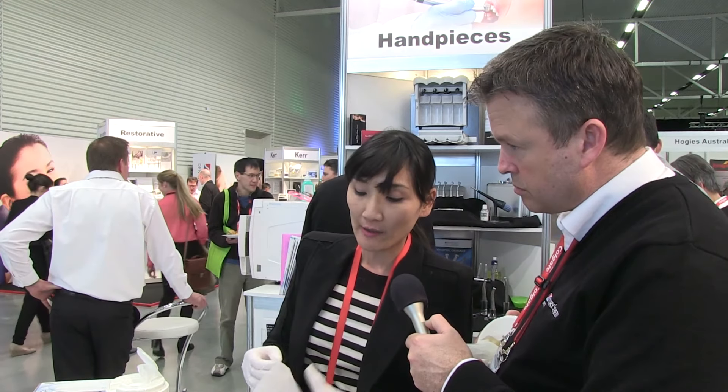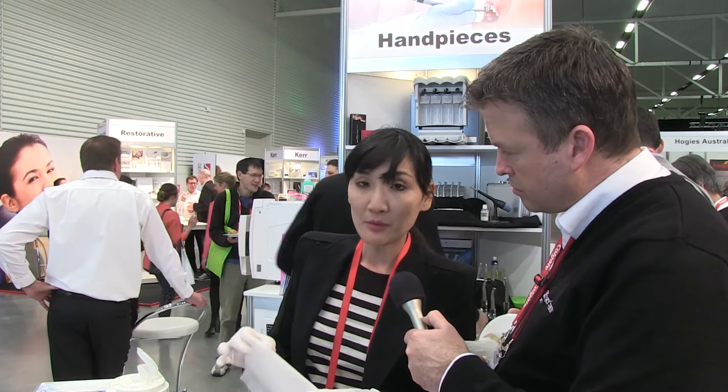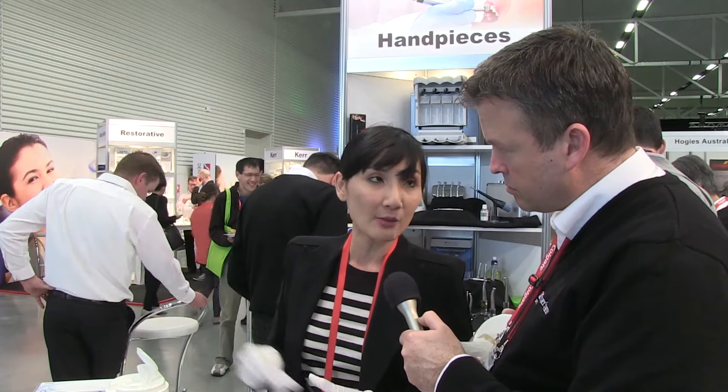The key thing is this product is very safe. The MSDS is not hazardous. There's no alcohol at all. It's not flammable, and there are no volatile organic compounds. In the U.S., it's the only product that, in terms of EPA category, is the safest available.